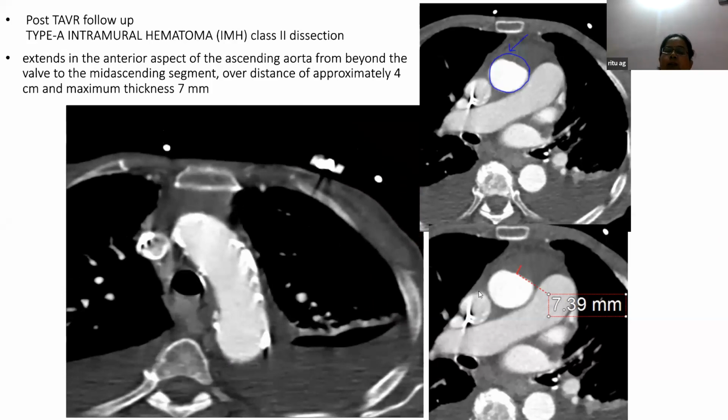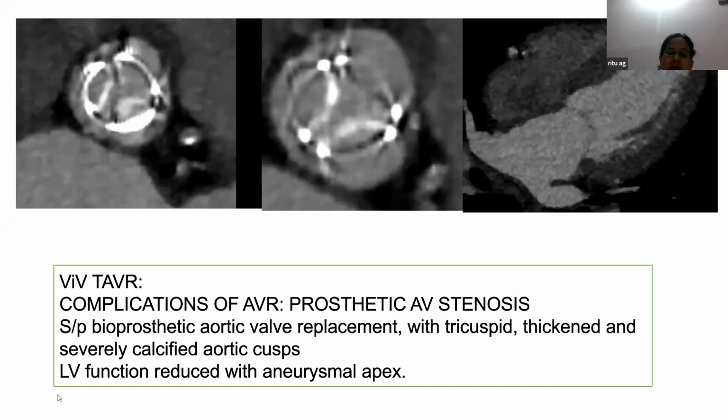And what we have seen is that TAVR imaging helps in pre-TAVR workup for selecting the valve, guiding the cardiologist for proper access site, and therefore the radiologist is an essential part of the TAVR team. And it also helps in managing the post-op complications.